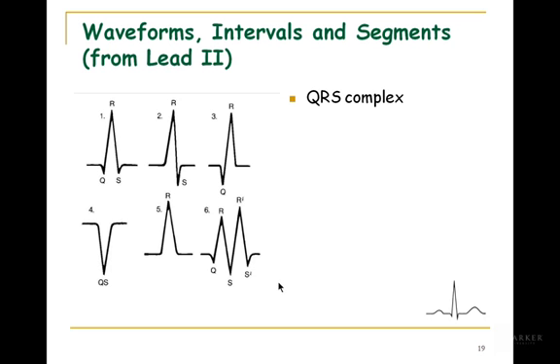For the QRS complex, if the duration is abnormal, one of the things it can be used for is to evaluate conduction through the bundle branches or the Purkinje system. I mean, bundle branches are part of the Purkinje system, since the Purkinje fibers allow the ventricles to depolarize at such a very fast rate. So if you've got problems with conduction within the Purkinje fibers, the QRS complex may be prolonged. In a later lecture we'll talk about voltage. So right now don't worry about voltage, but here we're just talking about duration.